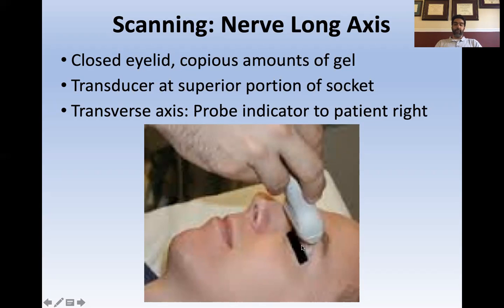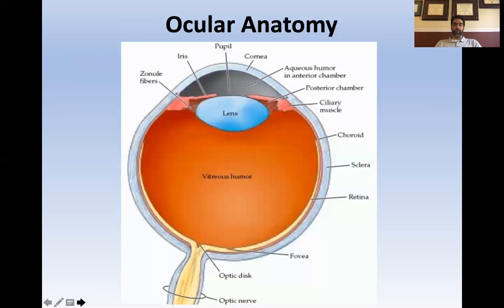Either you can take your last three fingers and put them on the zygoma, almost like you would when anchoring a needle when you're putting in a central line after you've entered the vein. Or you can stand on the other side of the patient, almost as if you're intubating the patient, and put your hypothenar eminence on the patient's forehead and put the probe on the eyeball. Either way, really, really light pressure on the eyeball is what you're going for.